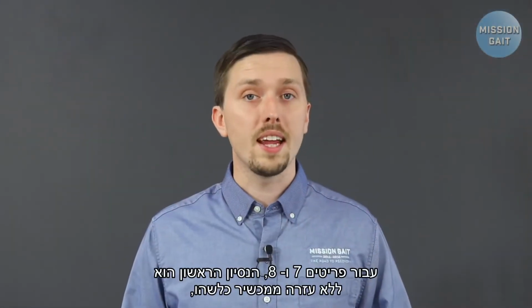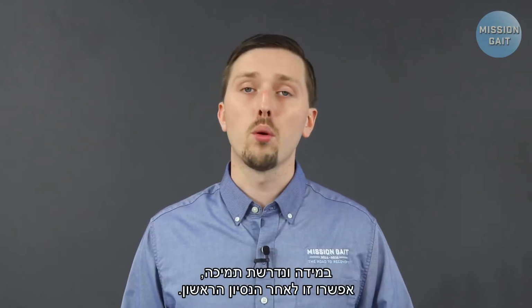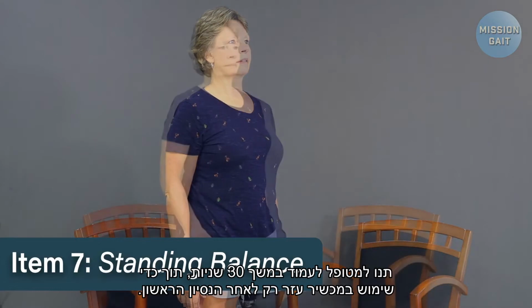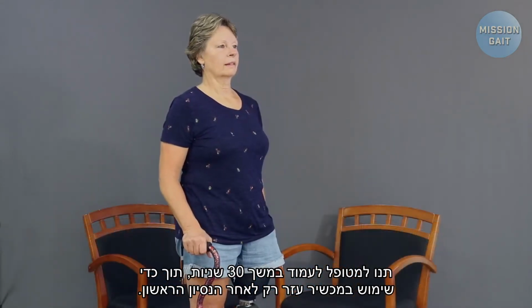For items 7 and 8, the first attempt is without an assistive device. If support is required, allow after the initial attempt. Item 7. Standing balance. Have the patient stand for 30 seconds, using an assistive device only after the initial attempt.